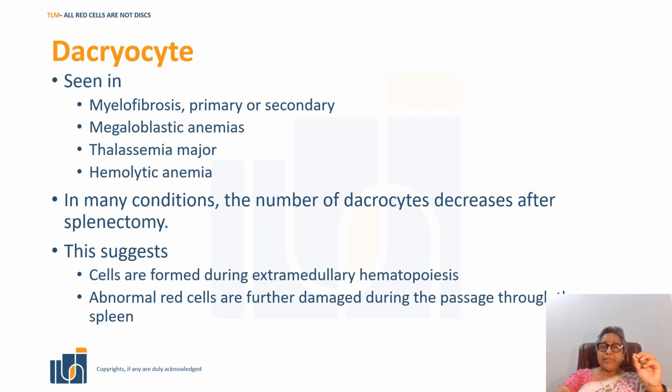So the presence of dacryocytes is significant, and one should look for the cell.